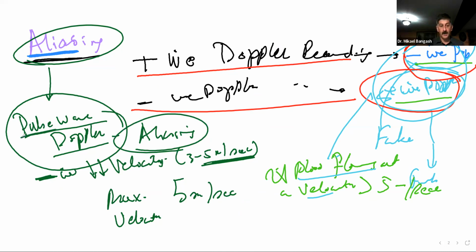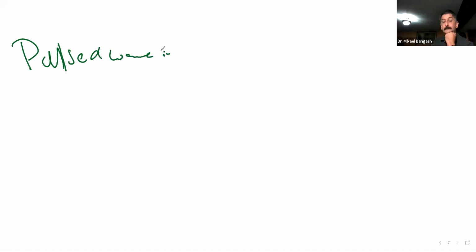Whenever you hear the word pulse, or pulsed wave, PRF should be the next thing that comes to your mind.